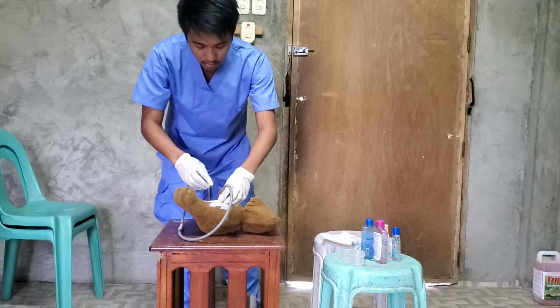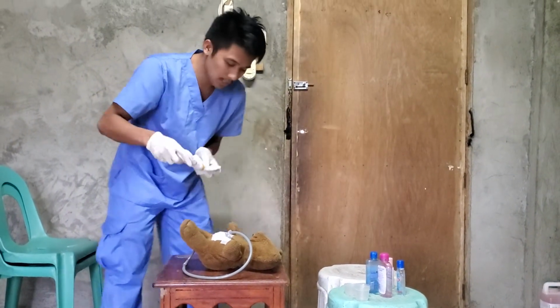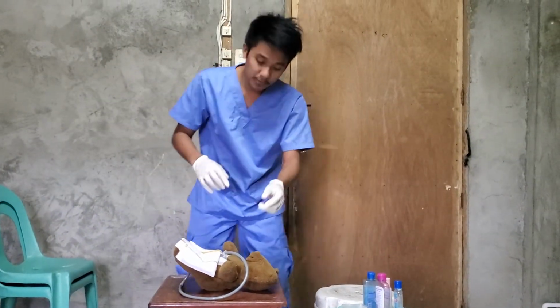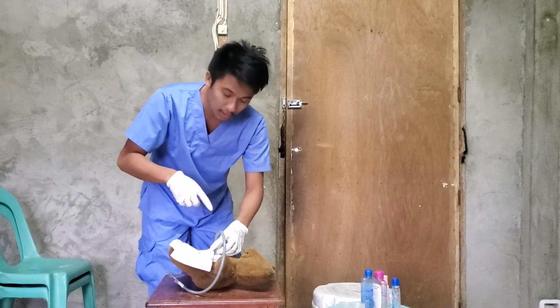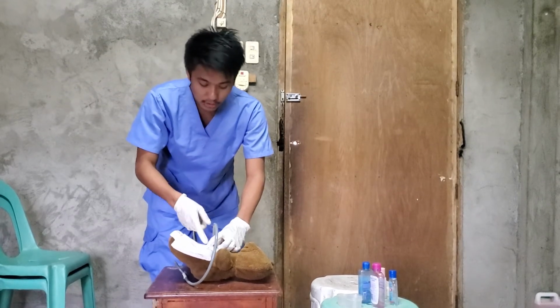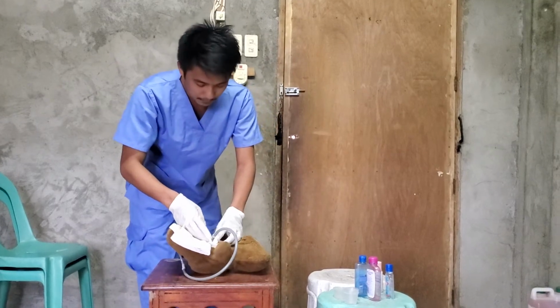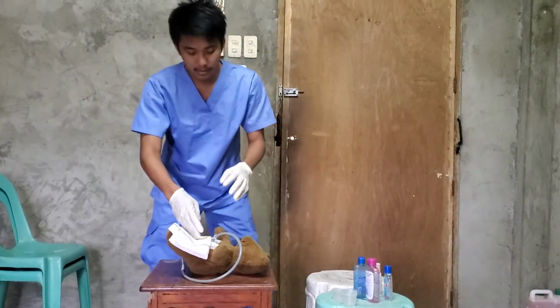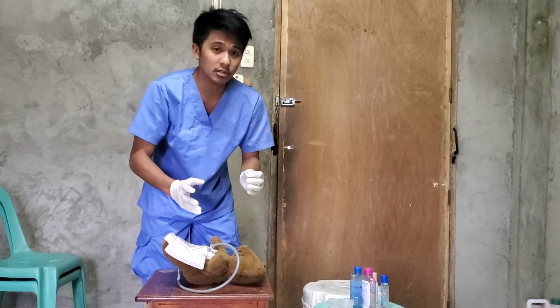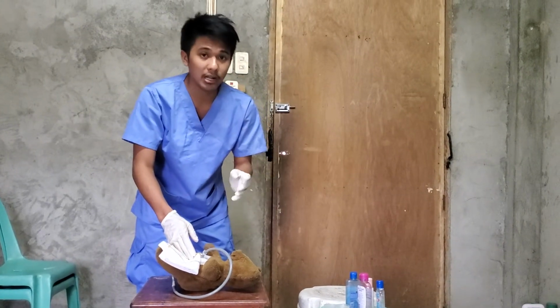Then after that, you also need to put the towel under the gastrostomy tube. Then the next step is to observe the abdomen for signs of malposition or obstruction of the gastrostomy tube. If the patient has abdominal distension, do not administer medication. Instead, you need to contact the parent, guardian, or healthcare provider.